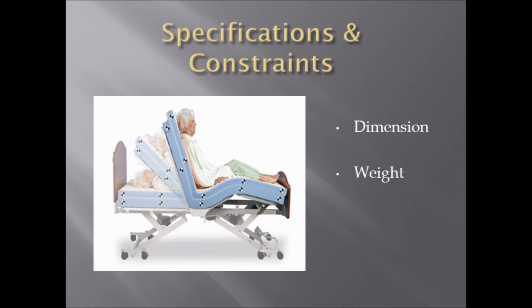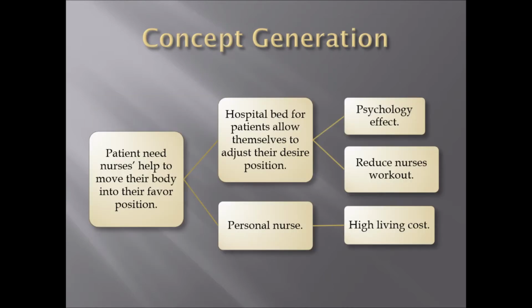To transfer patients easily. I'm Shinyee. I will carry on from concept generation. In the past, patients needed nurses' help to move their body into their favorite position. Nowadays, patients are able to adjust their position by themselves.